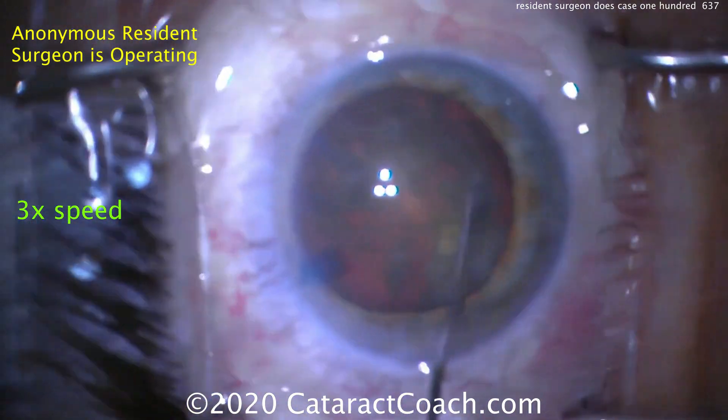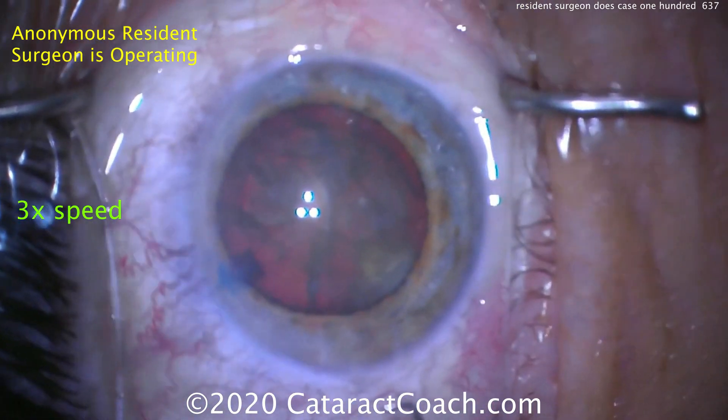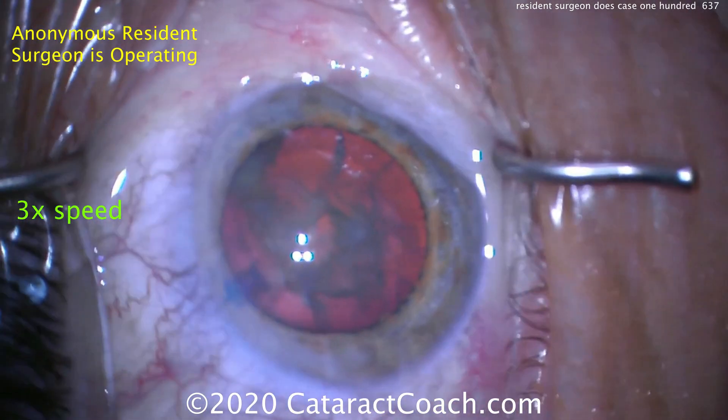Nucleus partially prolapsed out of the bag, and then it looks like it's being put back in the capsular bag. That looks good. More viscoelastic, and rotating the nucleus. I like those — all good maneuvers.